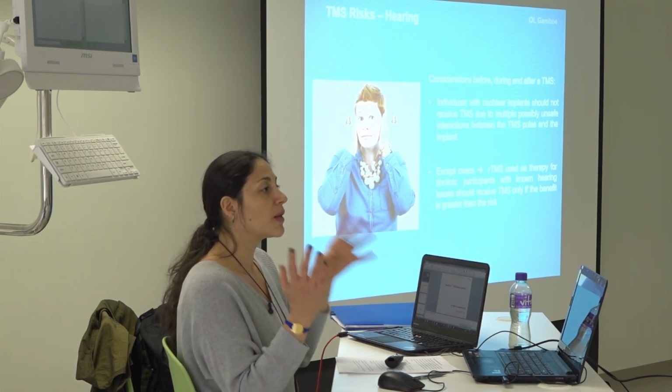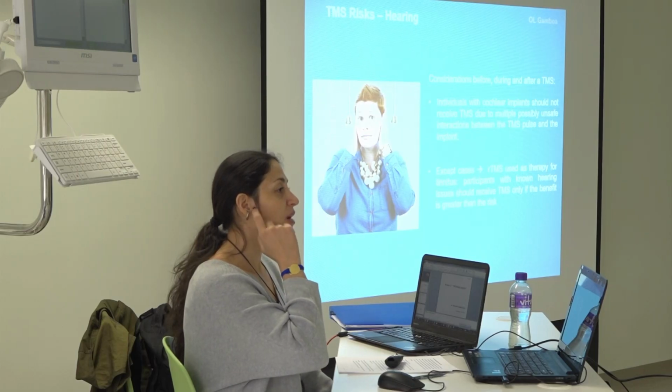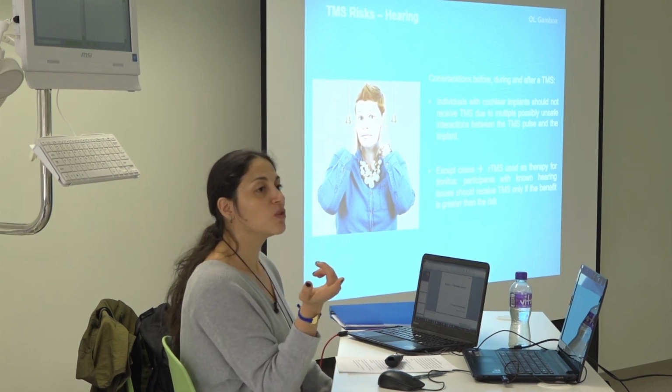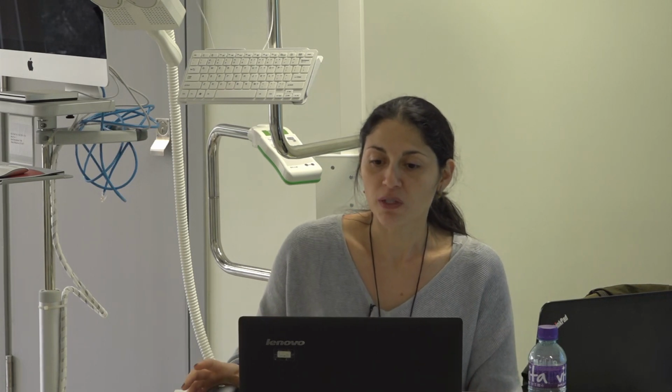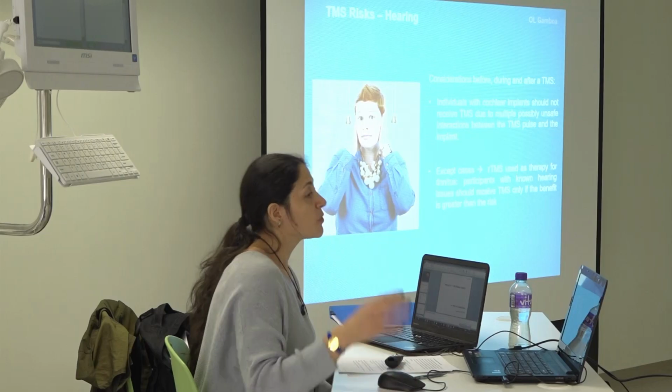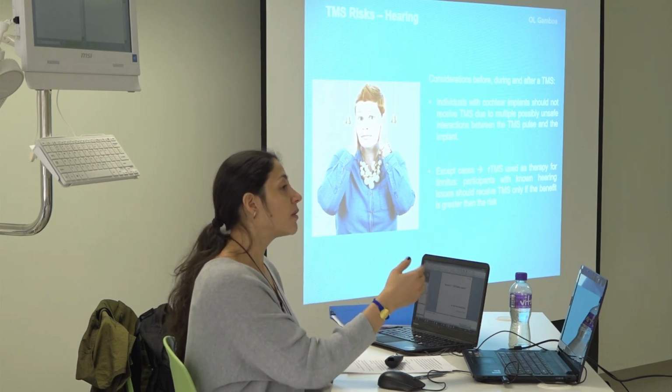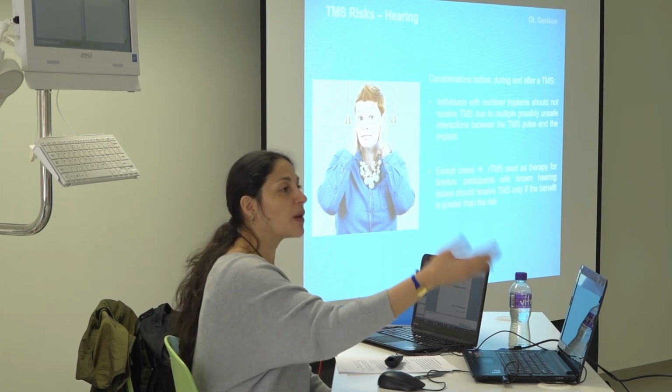If you are going to work only with healthy subjects, only work with healthy subjects. Healthy is healthy, free of problems. There are cases where you can apply it although the person has a hearing pathology, when rTMS is being used for tinnitus treatment. In that case, you could use people that have tinnitus, for example. You can use rTMS on a person with a hearing problem only if it will help them to improve their audition, okay?